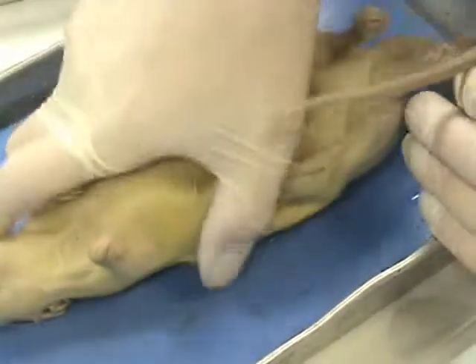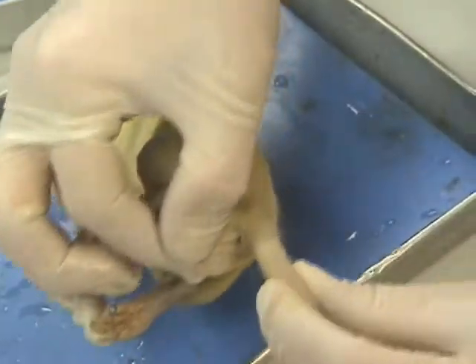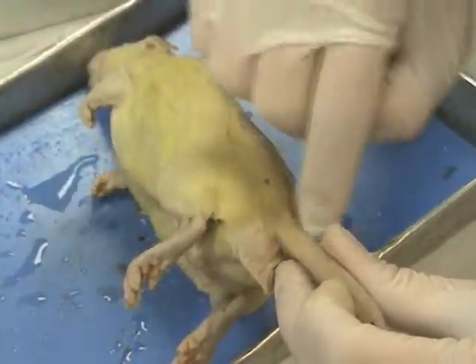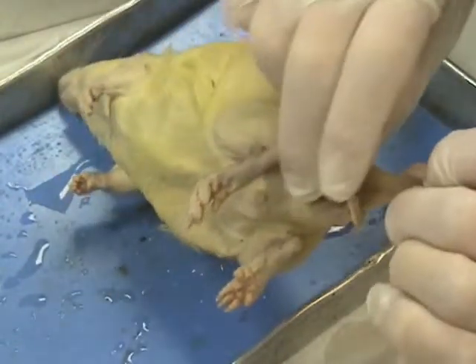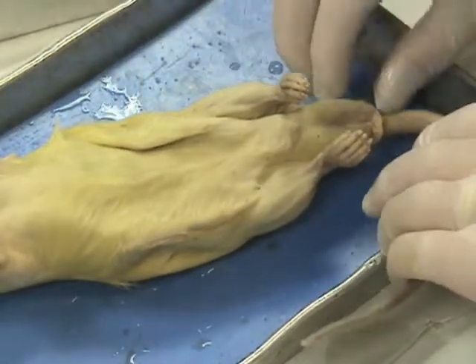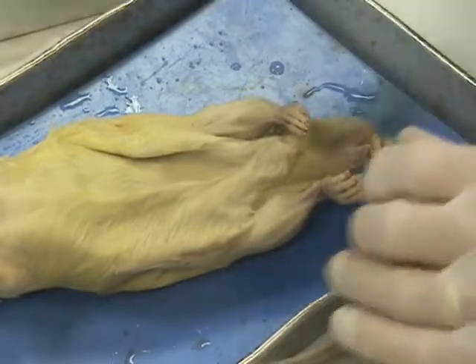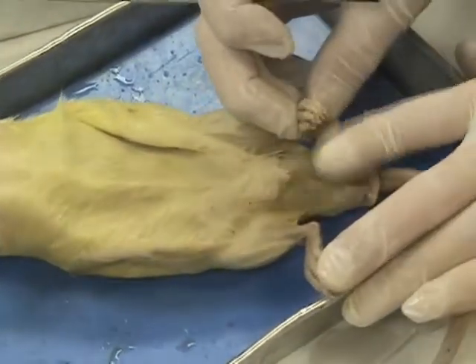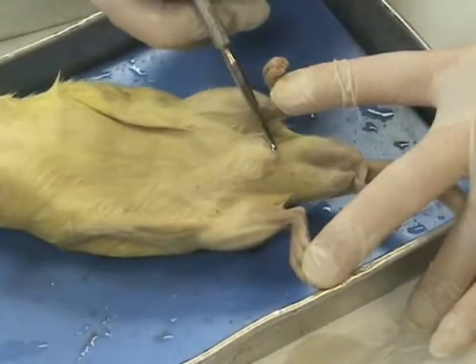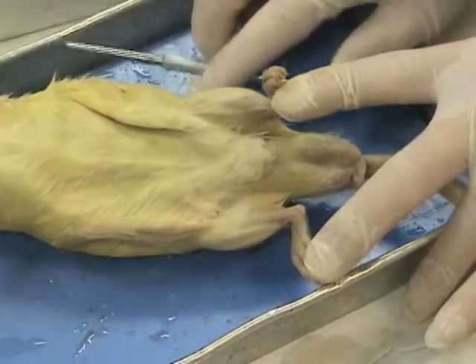This one over here, though, if we separate the tail back, pull back, we can find the anus, and if we go cranial to the anus, we do find a pair of testes, so indeed this is a male rat. In addition, we've got the testes. On the outside would be the scrotum, and if I pull these feet back a little bit, this right here would be the penis. So we have some structures here that are obviously specifically male.